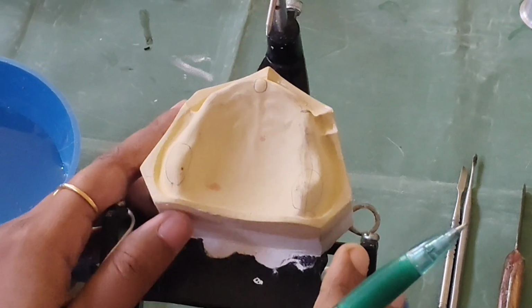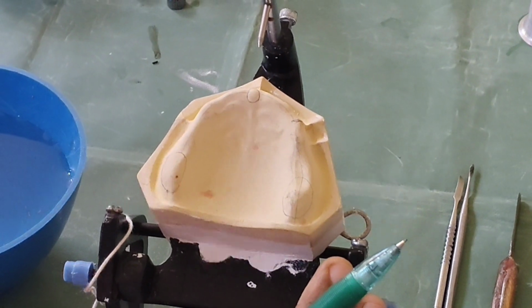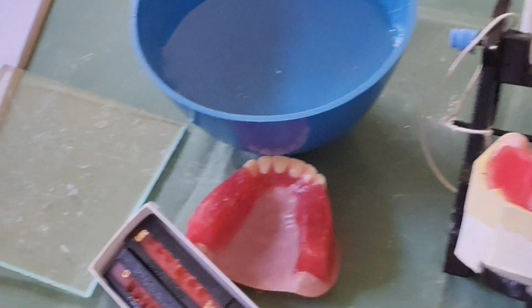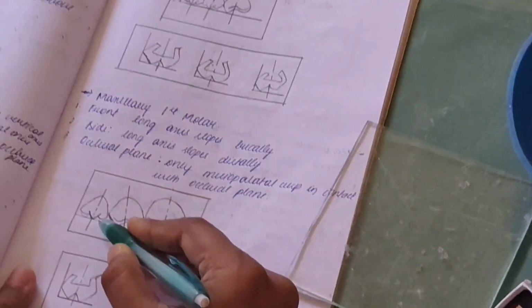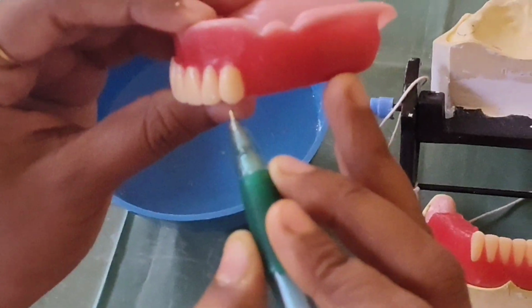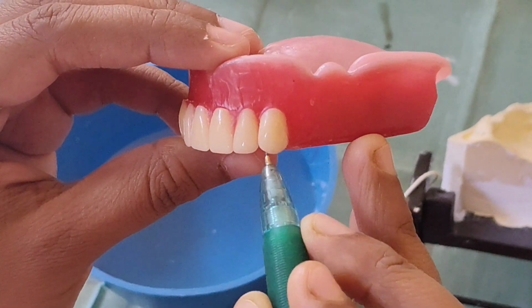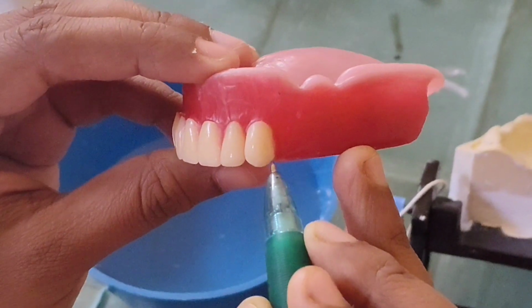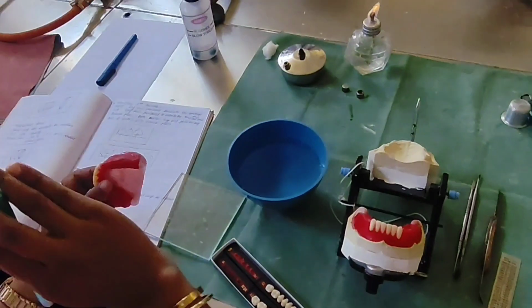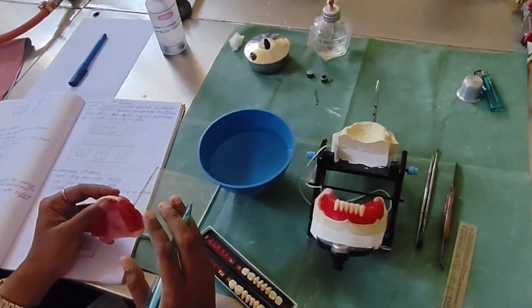So the mesial side won't be that much rounded. It will be a little bit round, like this. For example, this area will be a little bit like this. But the distal side, I'll show you. For example, you see these incisors and this canine. This is a little bit rounded, but this is a little above and this is more rounded. Okay, so the distal side will be more rounded.